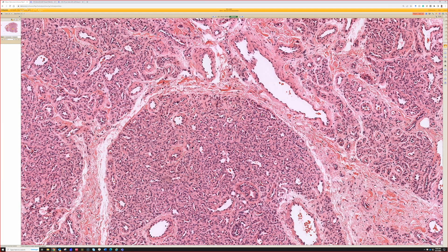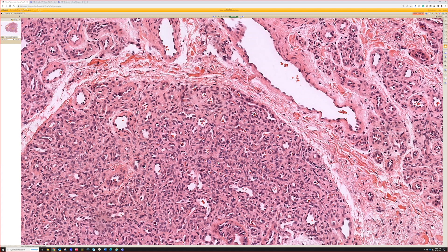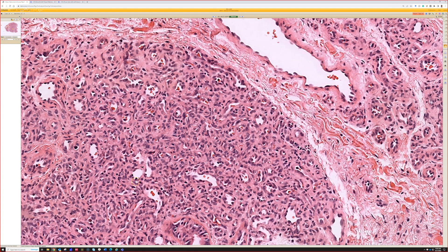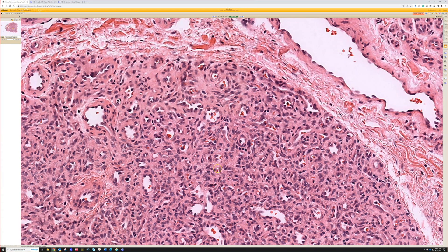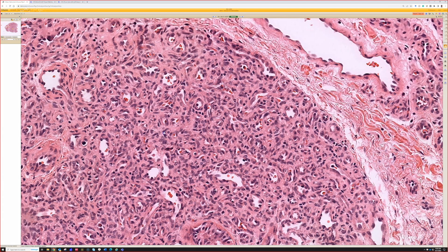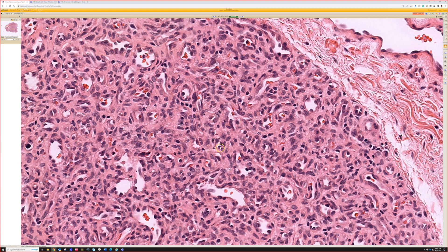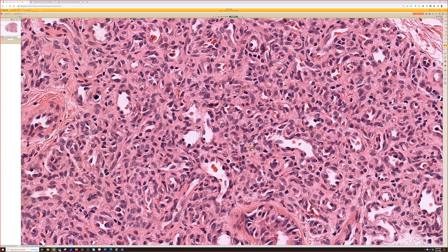The problem with these can come in their earliest proliferating phase — they can be so cellular and so closely packed that the capillaries look solid, like a sea of cells inside each lobule. You will have some of these larger dilated vessels, which are basically feeding vessels bringing blood into the lesion, but it takes some time for these vascular channels to open up. Even in these cellular areas, see this little one here — that's a lumen with three endothelial cells around it. There are channels that are still not fully open yet.